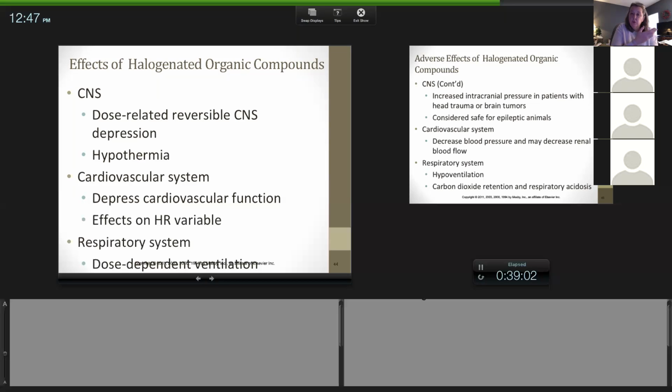But when they're just getting depressed from an inhalant, you see more of a gradual decline. Maybe their heart rate was 102, then it's 96, then it's 91, then it's 87, then it's 82. It's gradually dropping, and that's when I try to turn down the anesthetic and see if I can get it to come up.